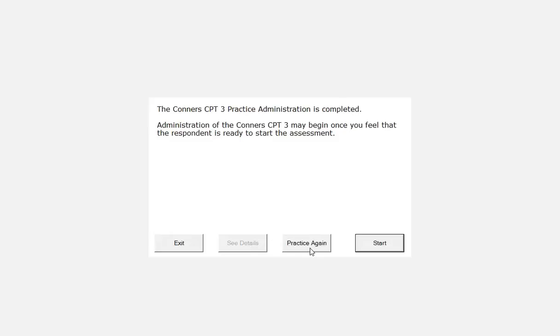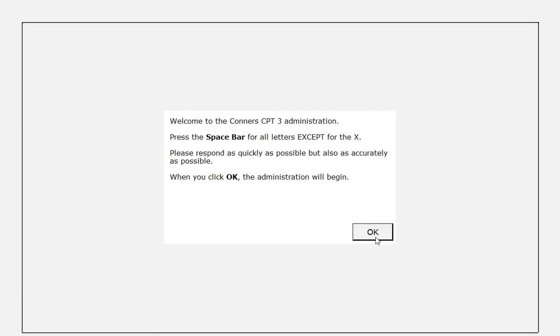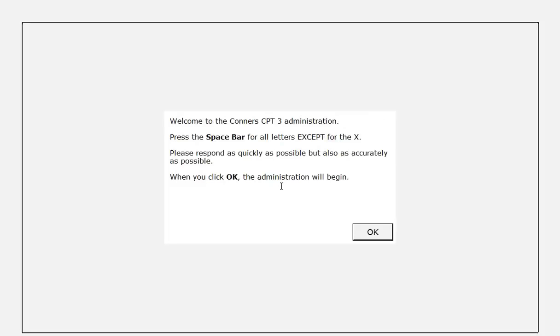Let's take a look at what the actual administration looks like. Welcome to the Conners CPT 3 administration. Press the space bar for all letters except for the X. Please respond as quickly as possible but also as accurately as possible. When you click OK, the administration will begin.